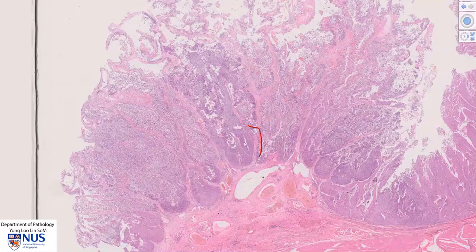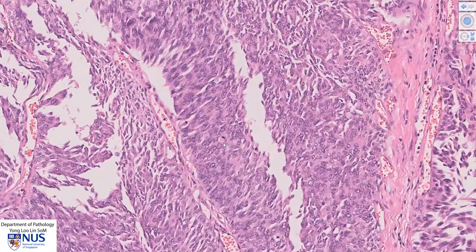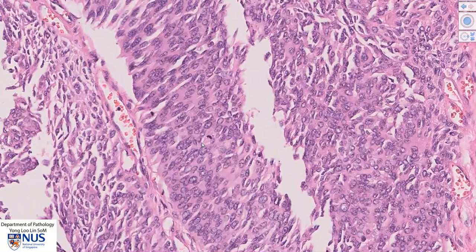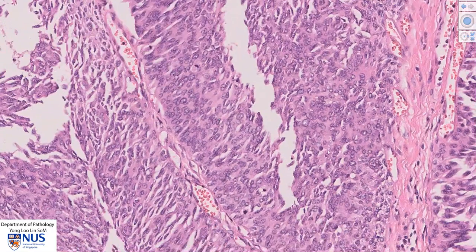Moving over to this area, we can see that the cells have higher NC ratios, or relatively less cytoplasm in comparison to the nucleus. The nuclei appear therefore more crowded. The chromatin is more coarse, and we also have more frequent mitotic figures. There is one mitotic figure here close to the base of the stratified epithelium. There is another mitotic figure here that is definitely in the upper half of the urothelium, and this is an abnormal location for a mitotic figure, signifying that we are likely dealing with malignancy.